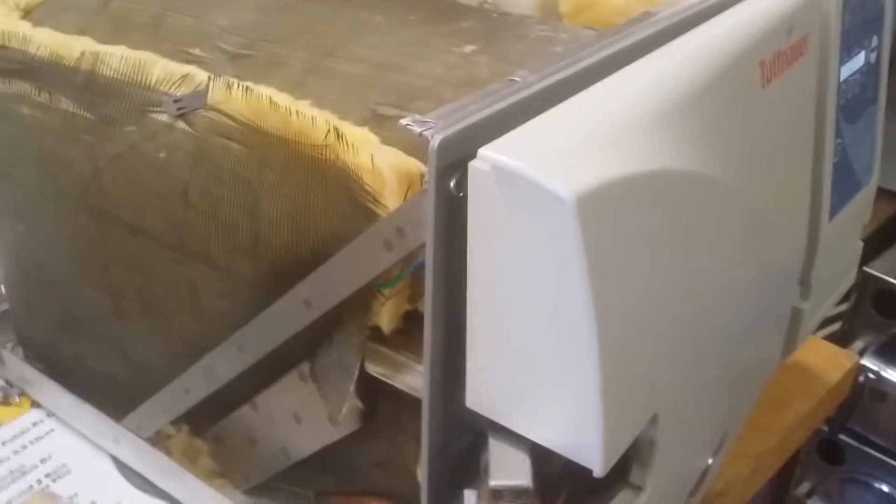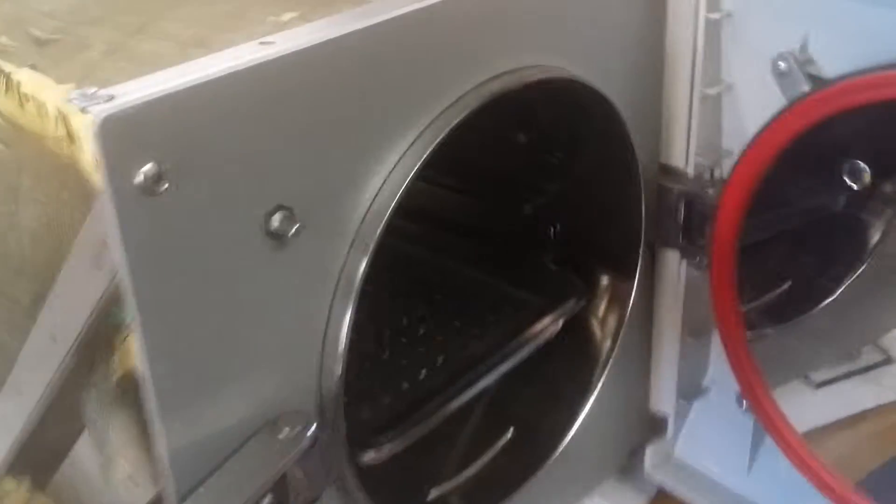On the top you can see the chamber, the insulation, and the reservoir. This side is almost empty — nothing too much on the right side. When you open the door, there's the chamber.